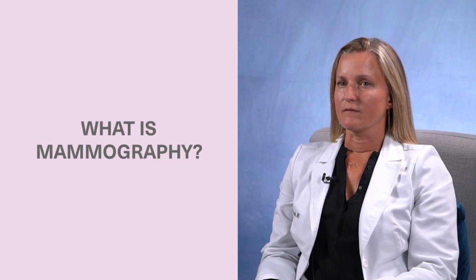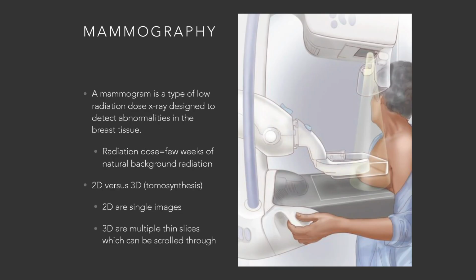So what is mammography? A mammogram is a type of low-dose X-ray designed to evaluate the breast tissue. And we get a lot of questions about radiation dose, so just a quick note on that. Mammogram is the lowest dose of radiation that we use for radiology exams, and we're talking about a few weeks of natural background radiation.